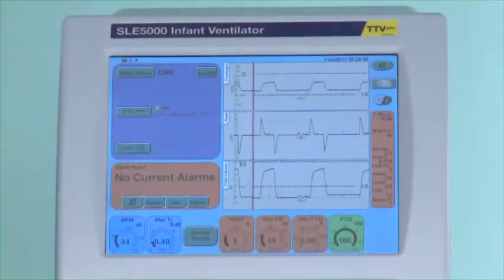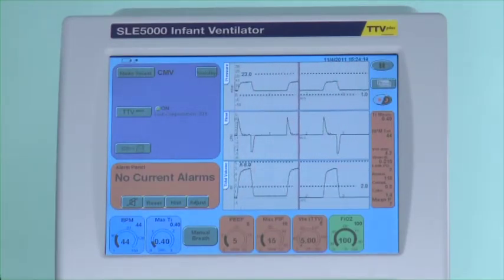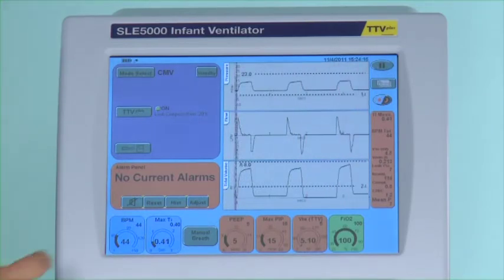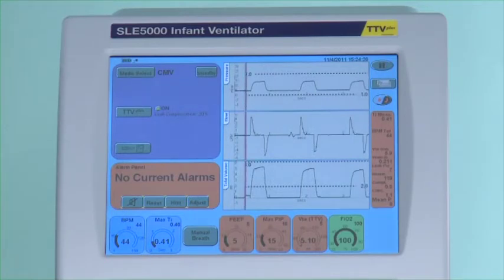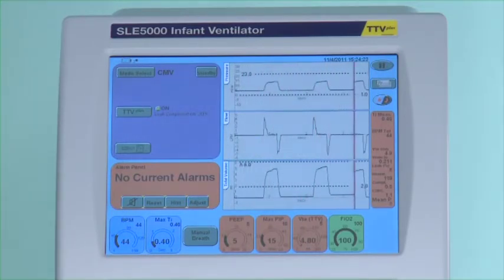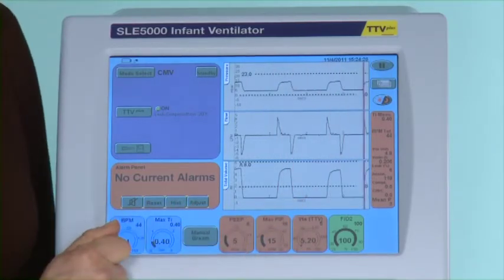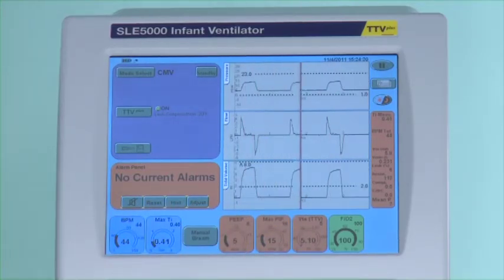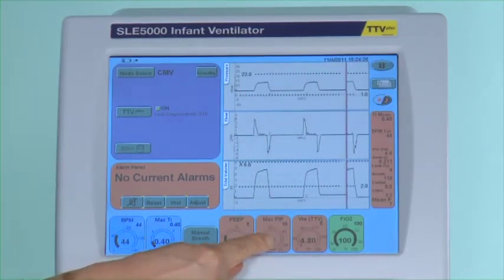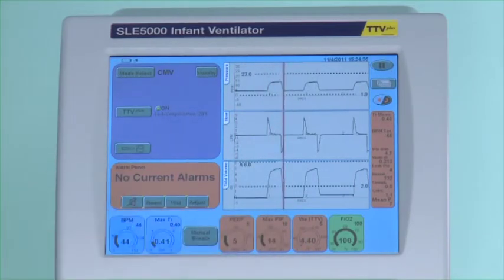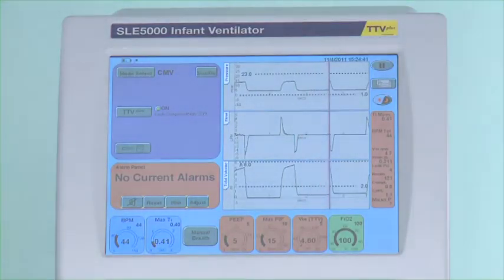You need to look at the baby to see why there is a low tidal volume — for example, is there a large leak in which case you won't achieve the volume. If the baby has a pneumothorax you will also not achieve the volume and in this case you may need to remove TTV plus. If the resistance decreases and the compliance increases the peak inspired pressure will continue to decrease whilst maintaining the correct end tidal volume.